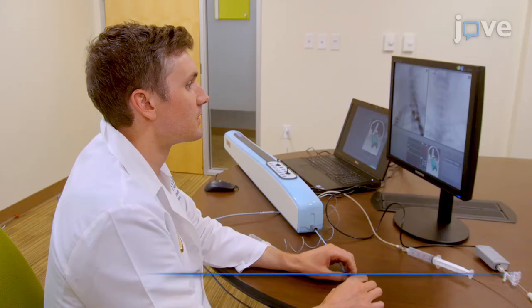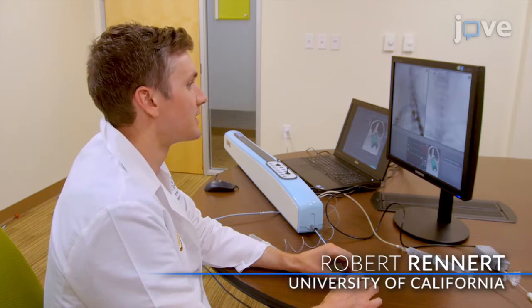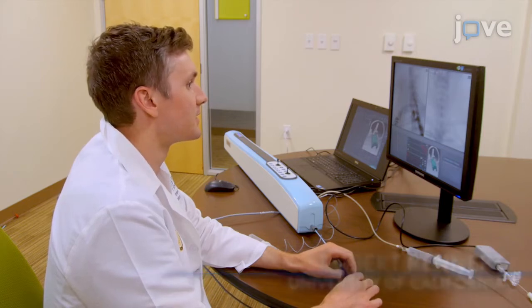Demonstrating the procedure will be Robert Rennert, a neurosurgery resident and former endovascular neurosurgery fellow.